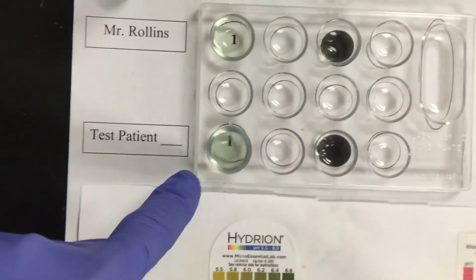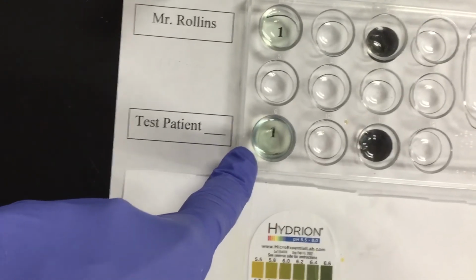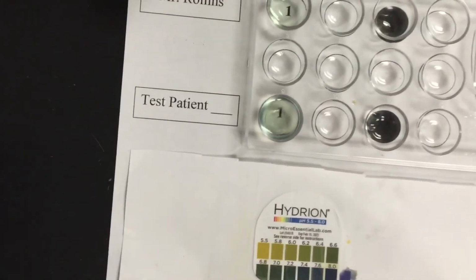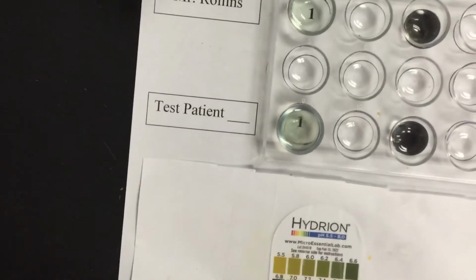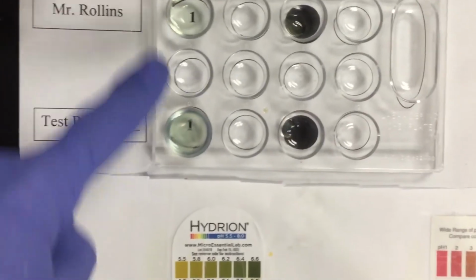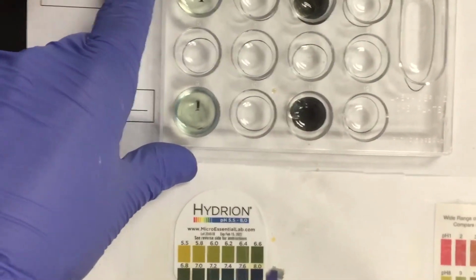We did the same thing for test patient number 13. It also is going to be negative for protein. It may look a little more blue to you, but if you remember, the sample itself was more translucent. If I'm adding blue biuret solution to it, it's not a chemical reaction. I need something that's pink or purple to change. It's more of a bluish solution because the urine was so translucent. So both my samples are negative for protein, both Rollins as well as patient number 13.